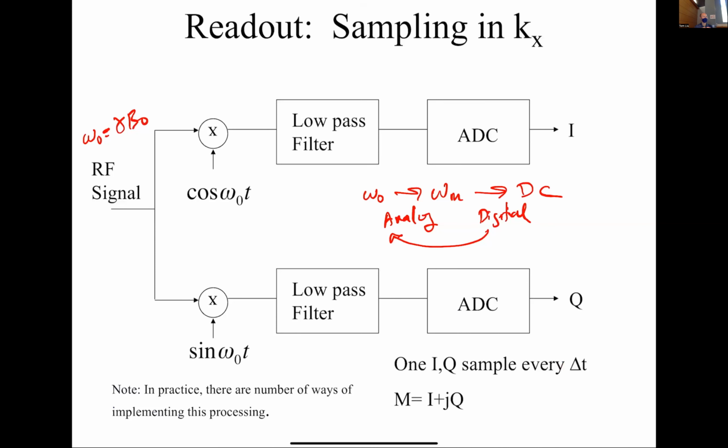We just had something where the temperature in the room of one of our scanners went up by about 3 degrees centigrade this week, and it changed the performance of the system. However they design the system, it only works within a small temperature range, and once we go outside that range, we have to worry about the room temperature. It's a pain in the butt, but that's the way it is.